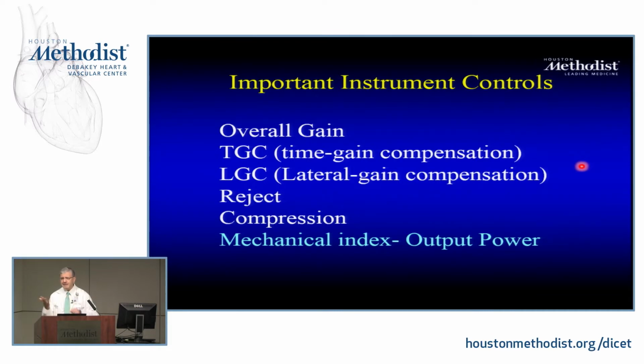There is the packet size. You talk about this packet, the packet size that goes in there. The line density, a word that you don't think about, but sonographers may think about. Line density means how many times I go up and down on my line of scan before I move to the next one. And the more I interrogate, obviously I slow down my frame rate, but I'm more accurate in depiction of whatever it is I want to depict, be it imaging, be it Doppler, be it whatever it is. So line density.